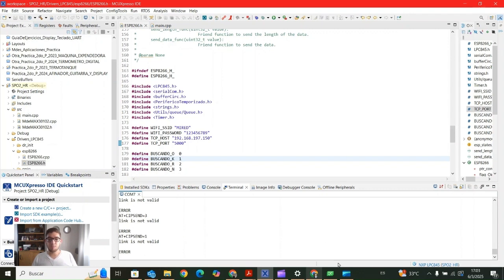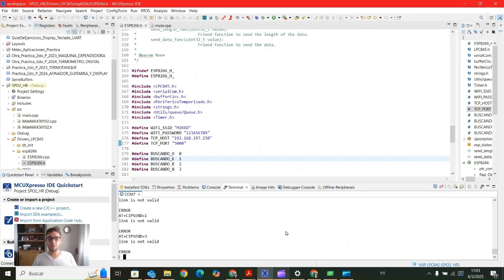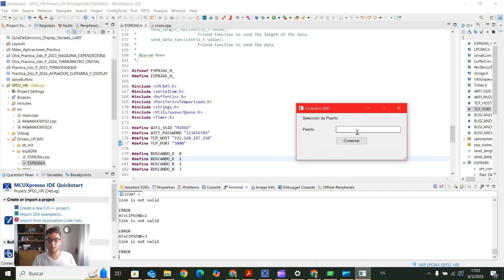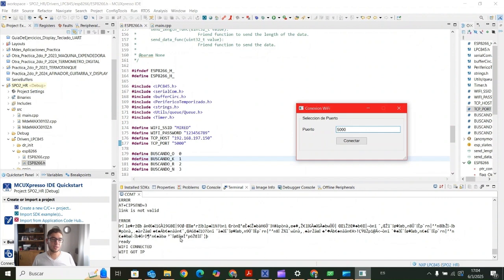Now we are going to shut down momentaneously, like turn off the project, like just disconnect the source, and we are going to again execute the interface, clicking on play button, and we're going to again choose 5000 as port number, and then connect again the source. Typically the best thing that you can do is connect the source again, or maybe just push the reset button. We see some characters related to noise.